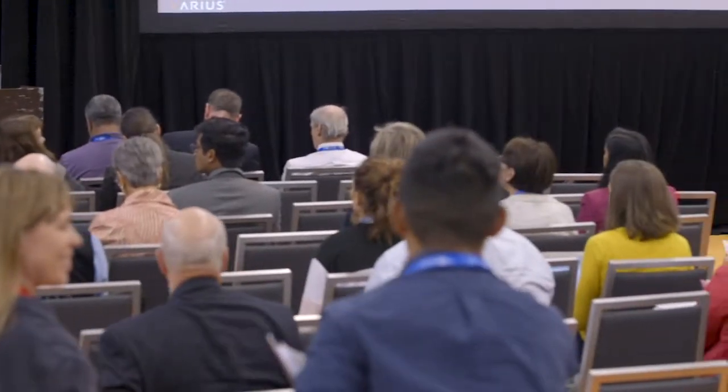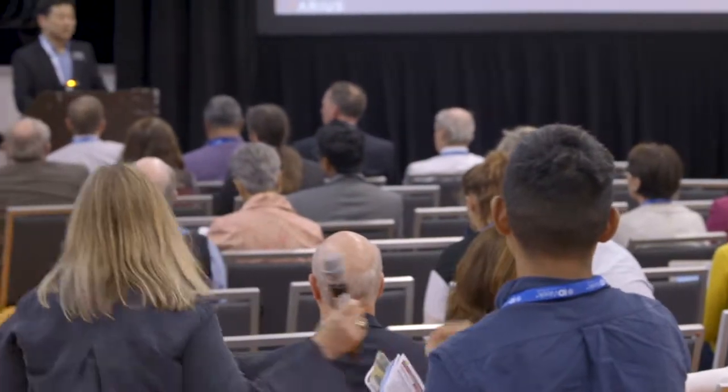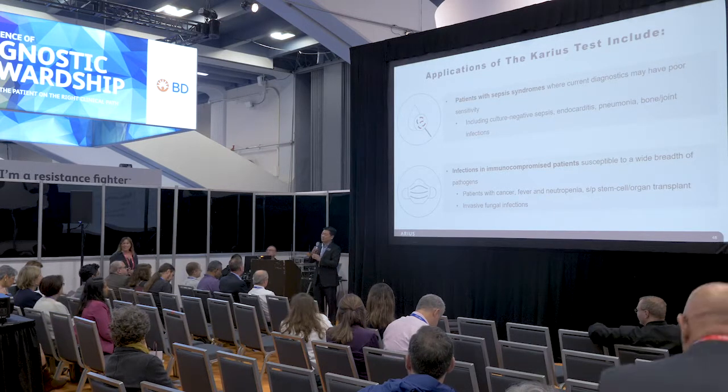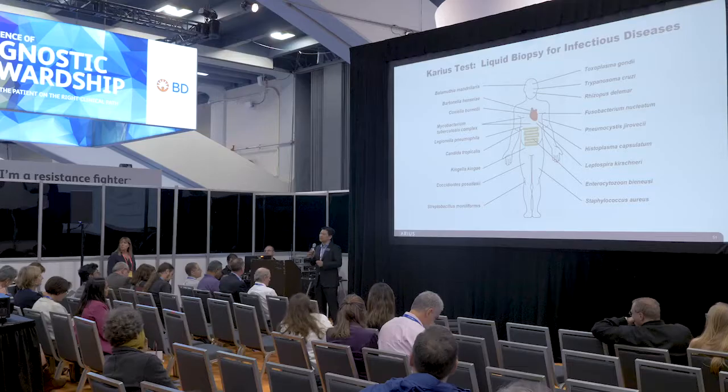Thank you. Can you speak to the negative predictive value of a negative NGS? So the question was about the negative predictive value of the test. When you look for all of these pathogens simultaneously, there are times when we'll have a negative test. Many times we will have a negative test. Now, we don't make any claims around the negative predictive value of the test. We haven't done the studies necessary to show that.